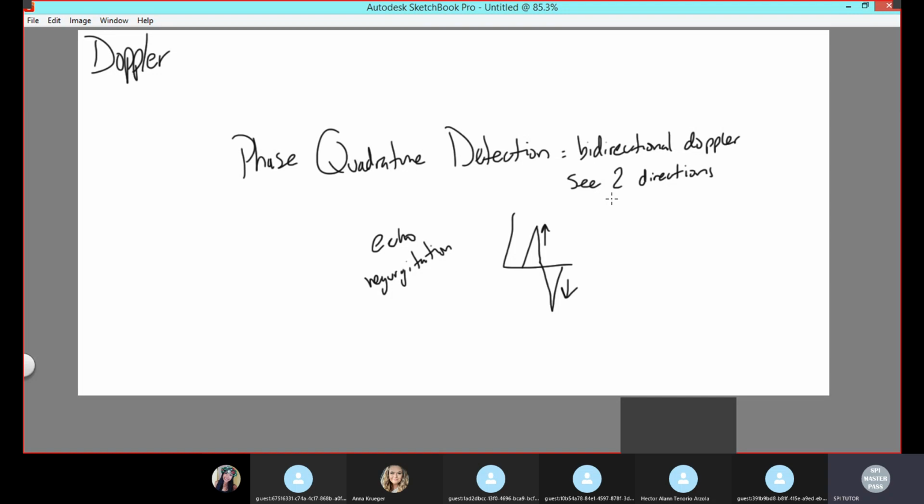In abdomen, the portal vein could be another example, because the portal vein is supposed to be hepatopetal flow, not hepatofugal flow. So how do you know that it's hepatopetal? Well, you know that it's moving towards you based on your velocity map, and we'll talk about that later.